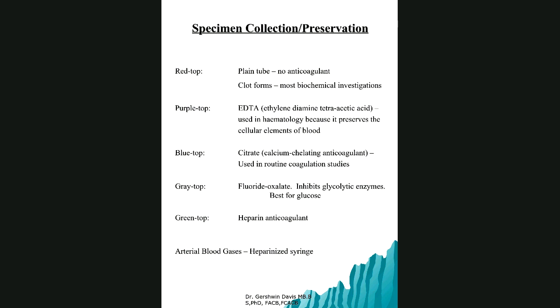One is the gray top tube. The added information there, we have known this from year one, your fluoride and oxalate: fluoride inhibits glycolytic enzymes, and oxalate is the anticoagulant. The other thing you need to appreciate is that the gray top tube is used to do analysis for what? Anybody listen to the presentation? What else do you use gray top for? Because we all know glucose. Yes, that's a common one. Everybody knows glucose, but it's also used for alcohol. So don't forget that. That's very good. Keep that in mind. They tend to forget that one.